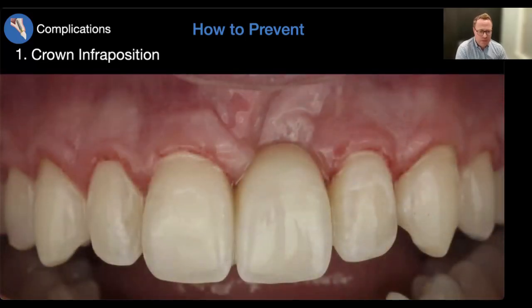Again, you have to be very meticulous about bonding this. You have to go over how to clean around it because, again, it's not the easiest to clean. And this patient, at his age, oral hygiene is probably not his big priority yet. That will change soon, hopefully. We've been working with him, and so I've seen him frequently to ensure that.